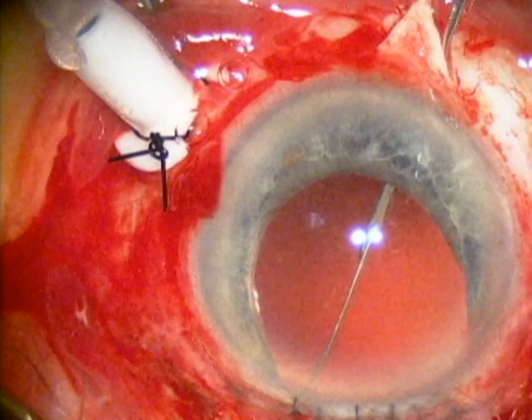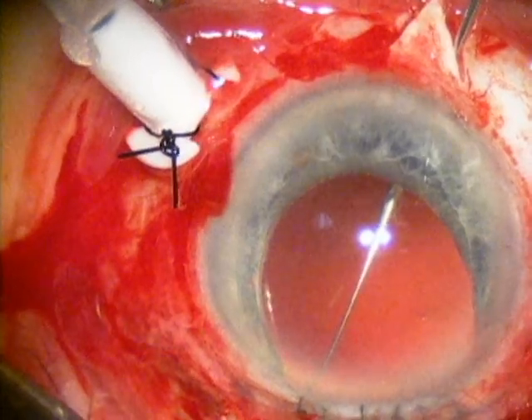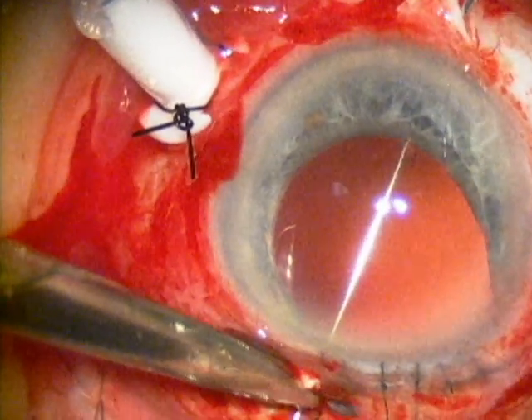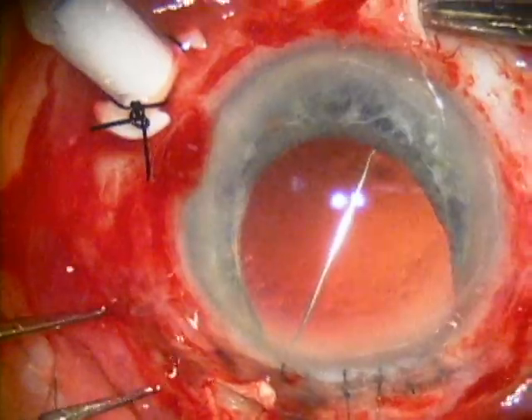By passing the two prolene sutures across the pupil, a little more support is given to the intraocular lens. Also, you'll see later in the video, by tying a loop around the lens, it is possible to rotate the knots inside of the eye which helps prevent future exposure of the knots through the scleral flaps.